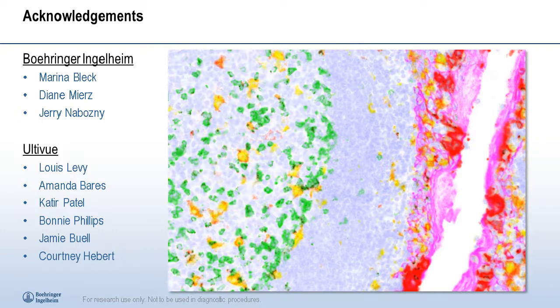Absolutely. This is a simple one, I think, although I guess it will depend on the particular assay. They say, how much time does it take to optimize a multiplex IHC assay using the Ultivue technology? Well, thanks, Rich, and that's a great question. I think, as you saw in the presentation, we were able to take 2 4-plex kits and swap out antibodies because they had compatible barcodes, and so that took no optimization time.